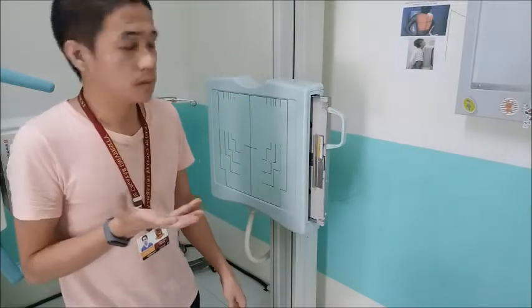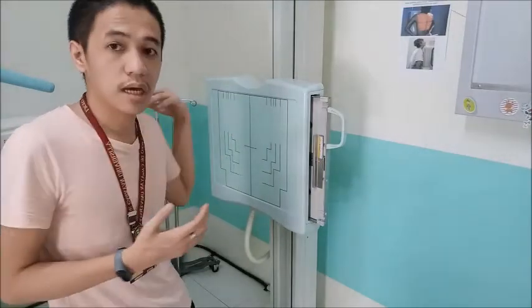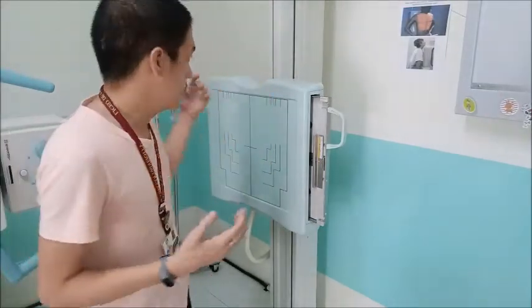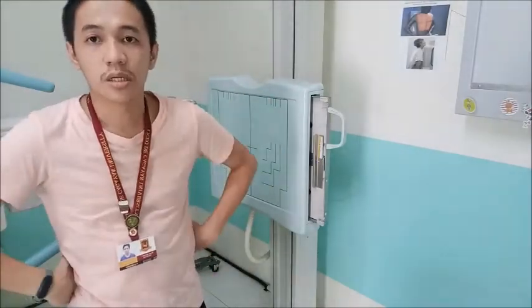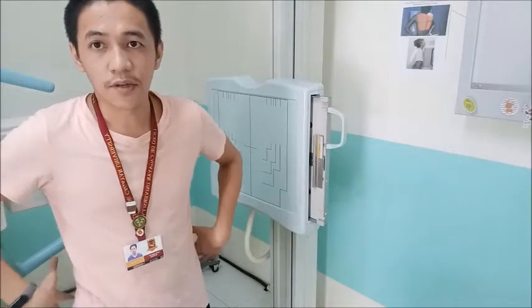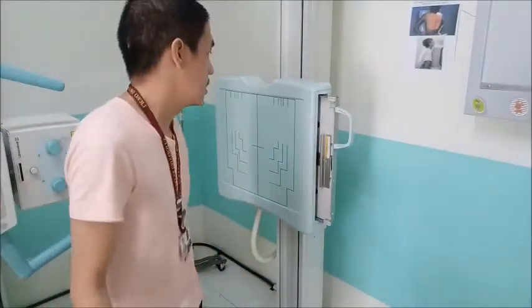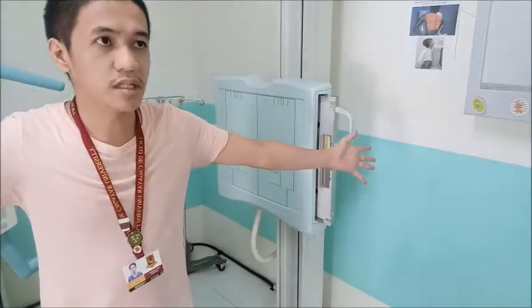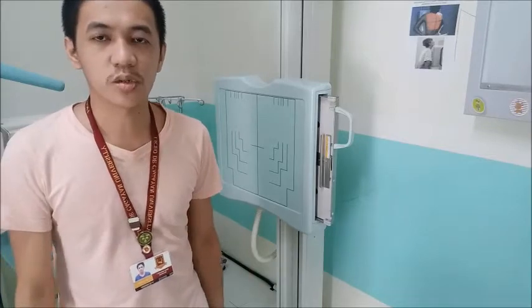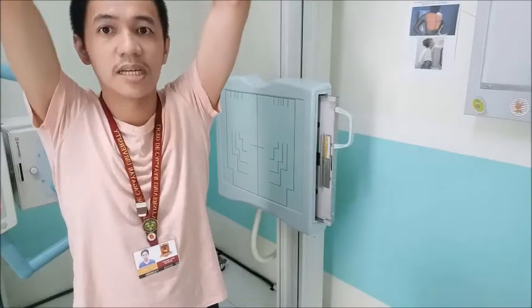In that case, just have them stand and face towards the X-ray tube, with the same position. You can have the patient raise the arms like this if the pediatric patient can understand and follow the instructions. And if the patient will not cooperate, just have the patient do like this, or maybe the hands should be placed on the side. But as much as possible, the arms should be raised.